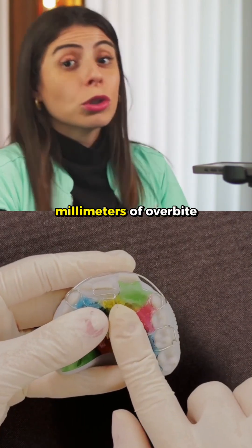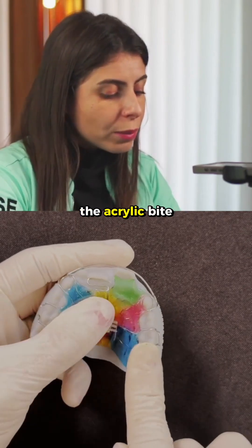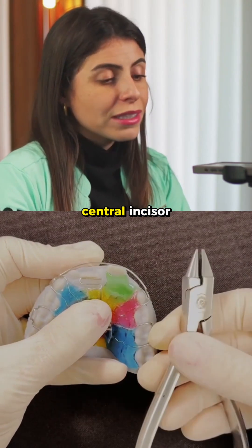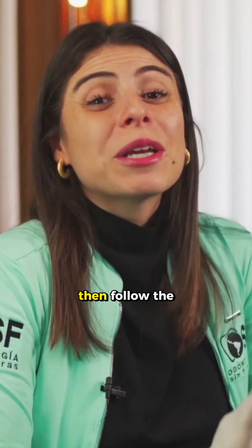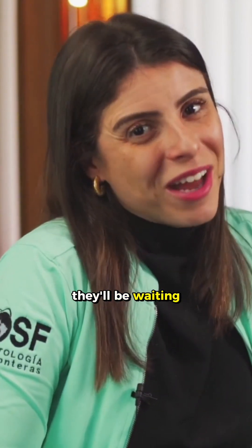If you have more than 2 mm of overbite, it's very interesting to place an acrylic bite plate in the posterior area. This way, you will manage to uncross this central incisor much more easily. If you like this appliance, then follow the series as there are still 11 appliances to come. They'll be waiting for you.